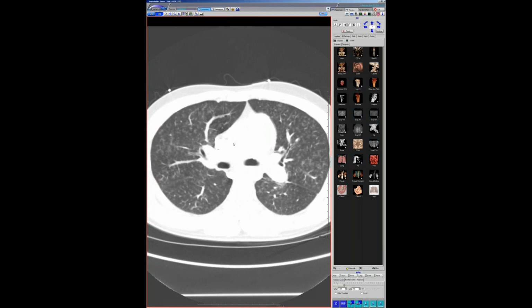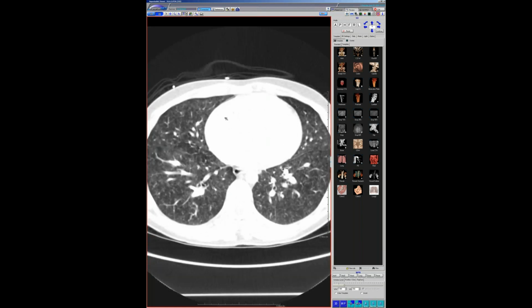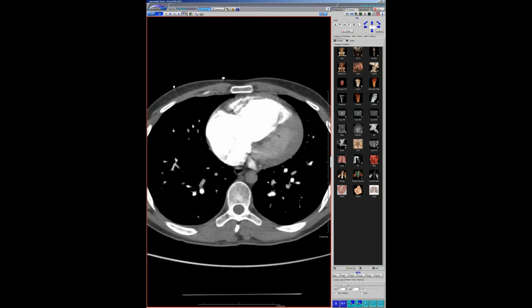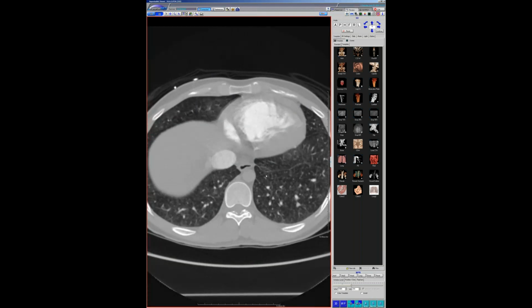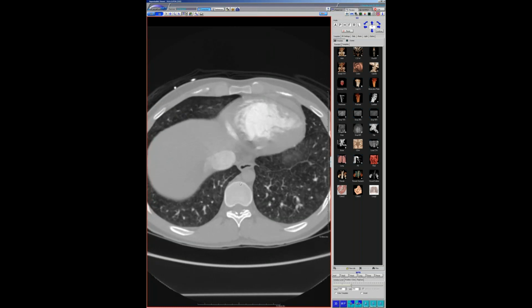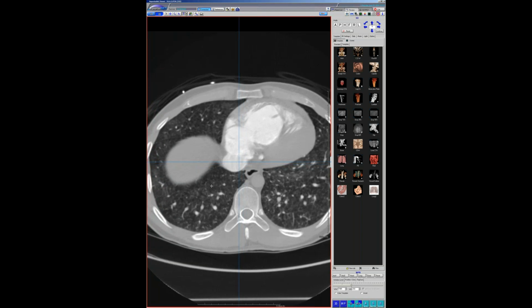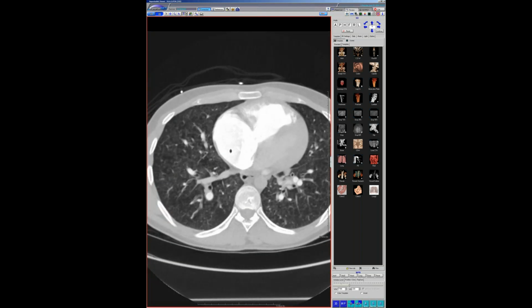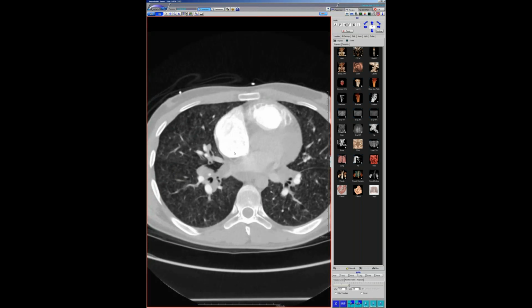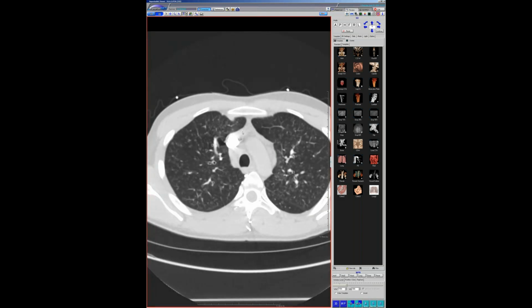Unfortunately, we're not going to get tissue on it, but was there any left heart dysfunction? No. Left heart was completely normal. And no edema, which would be unusual for this degree of PVOD, right? Yeah, exactly. So the PCH ones can have not a lot of septal thickening. I mean, you could say there's some mild septal thickening, but it's really not bad. He has no effusions. Left heart's pumping good. But these biggish nodes.